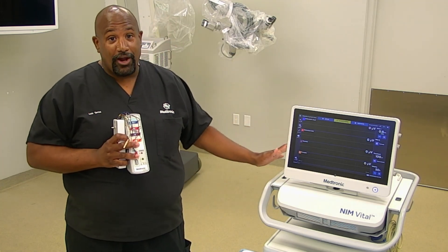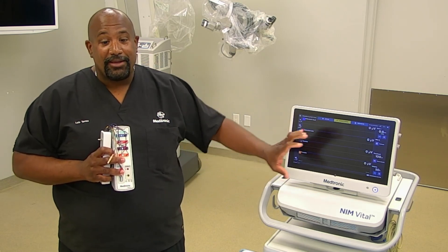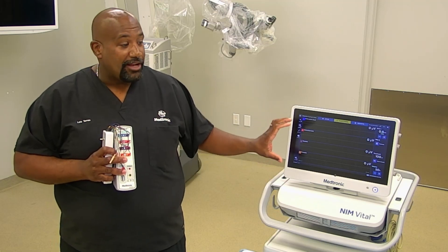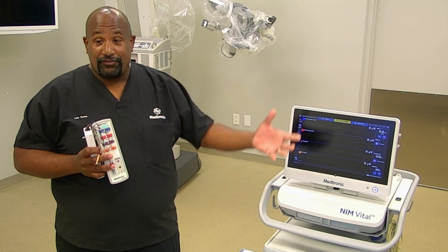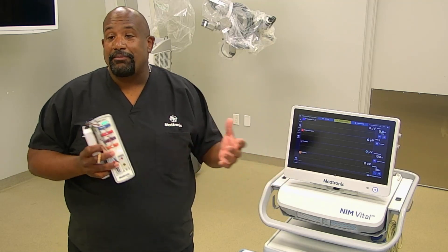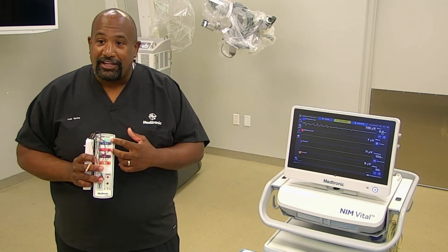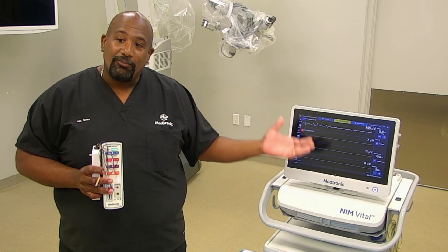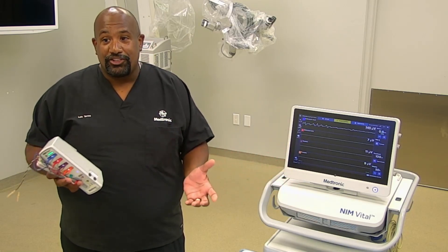Your muting is also wireless. So any time they use electrocautery, the NIM is going to come up with a warning on the screen that says muting — monitoring is disabled. If that warning is there for more than 30 seconds, the NIM is going to alarm to let you know that it's muting. Also, if any electrode comes out of the patient interface or out of your patient, the NIM will also alarm to let you know there's an issue so that you can check on that.